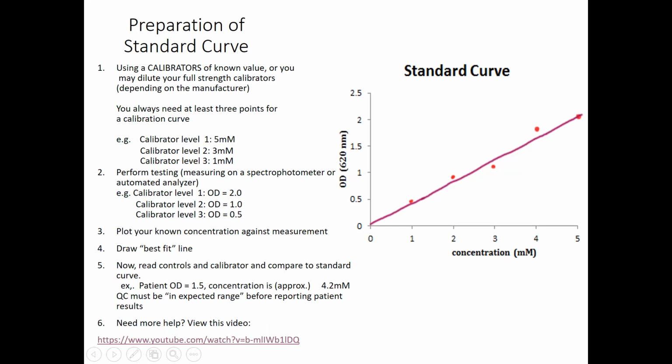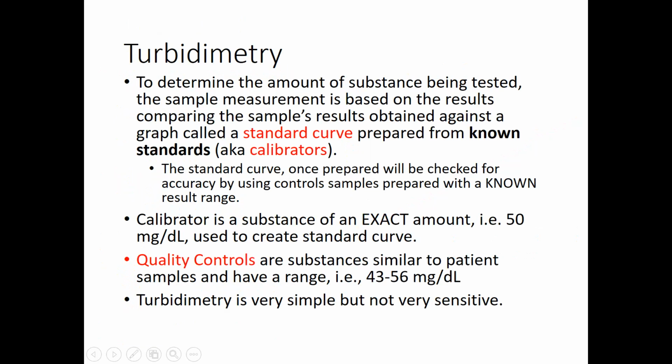She'll actually draw it out and see. If you haven't, you may have done a standard curve before in intro class, and you may already know how to do this. But I'd like to make sure you need to know how to do this. So standards are the known, they're a calibrator. Quality control has a range. It's helping us to interpret the standard curve to make sure we drew it correctly.